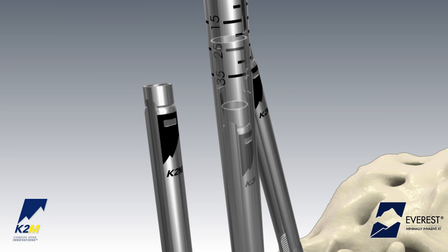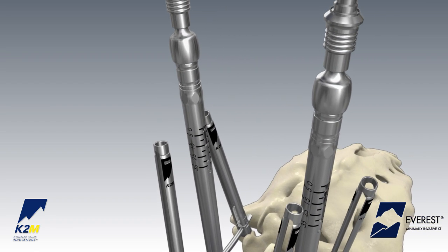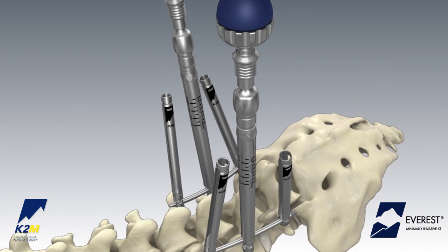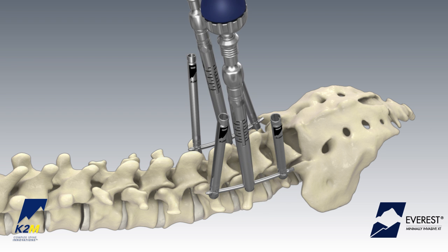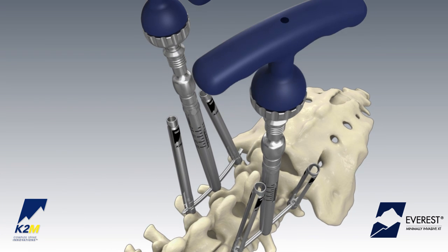Slide the instrument down towards the screw head until the instrument engages with the reduction slots on the exterior of the extension tabs. Once engaged, rotate the proximal knob clockwise to begin reduction. External markings on the tab reduction tunnel provide a reference for needed depth until the rod is fully reduced.